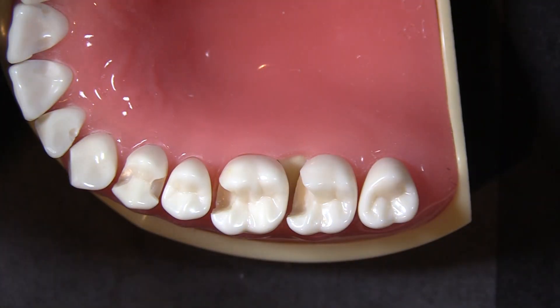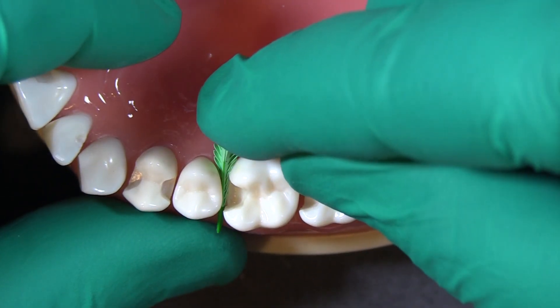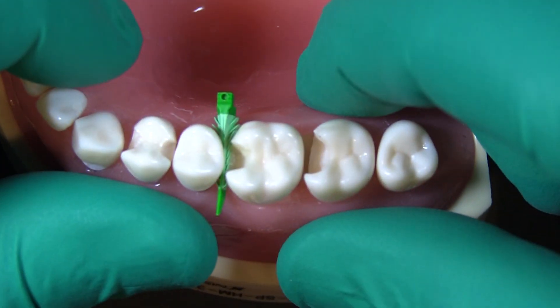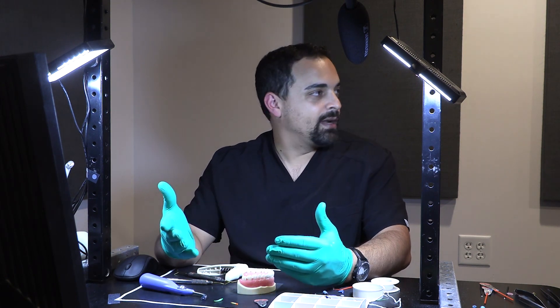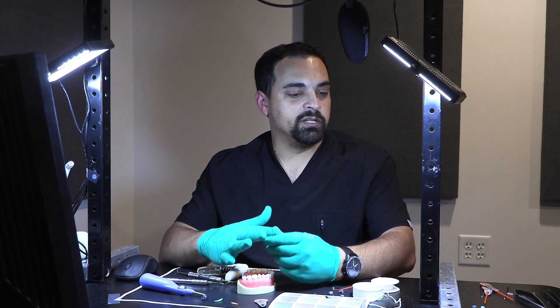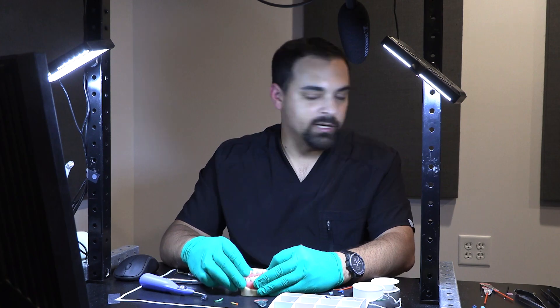At this stage we are free to restore virtually like a normal class 2 restoration — the fins engage nicely and we can really proceed like a normal class 2. If you're going the indirect route, you're now ready to pick up the margin nicely and have a much more predictable crown-to-margin interface, whether you're scanning or taking an impression.